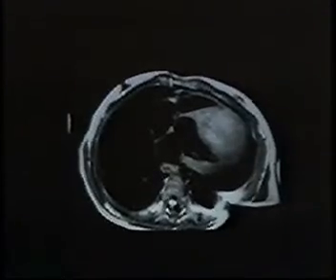I have no idea what the picture was post-operatively. If I had a post-operative study, I could tell. I suspect that he did not take much tumor out, and this probably is a slow-growing tumor, if it's growing at all, but I can't prove it without that study. MR is extremely useful in following up kids.